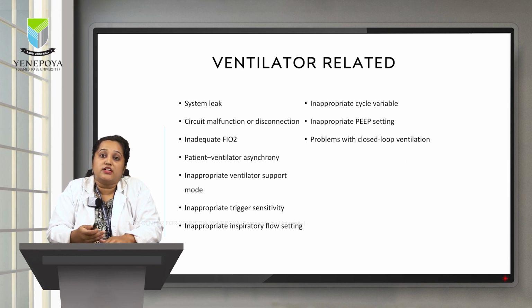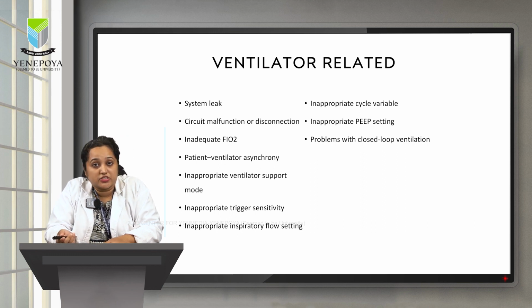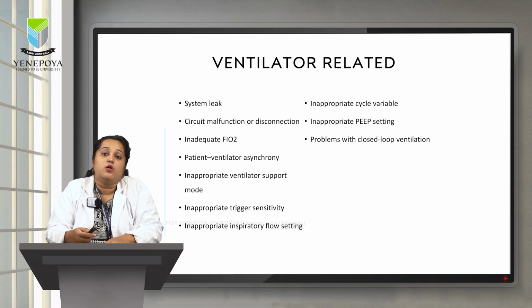Inappropriate ventilator support mode. Now imagine there is a patient who is not completely conscious, who is not in the state of mind to breathe or have a good respiratory drive, and you have put the patient on pressure support mode of ventilation. What's going to happen is the patient is going to get fatigued. After one point, the patient will be completely in distress because he is not getting enough breaths. So, even setting an inappropriate ventilator mode is going to affect the patient and can result in sudden distress.